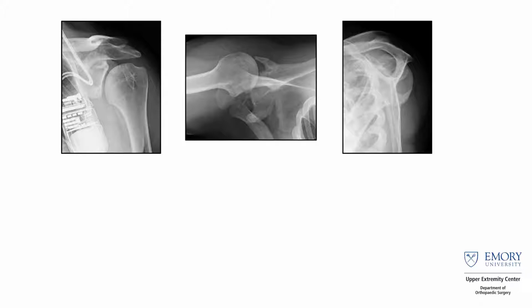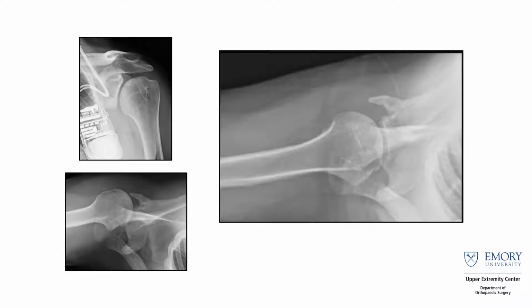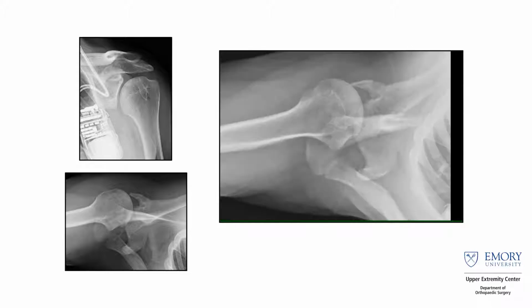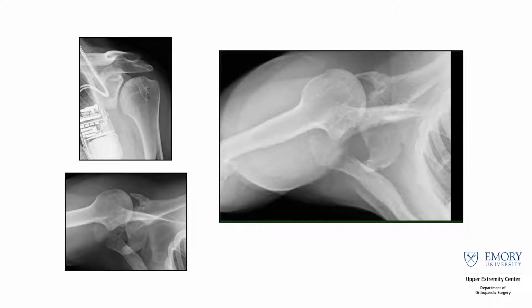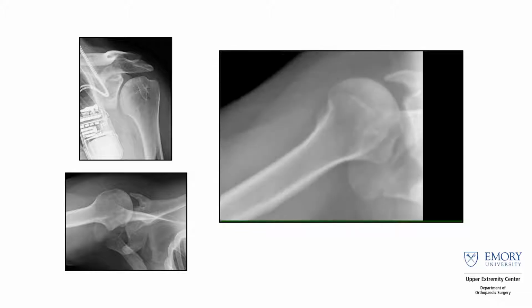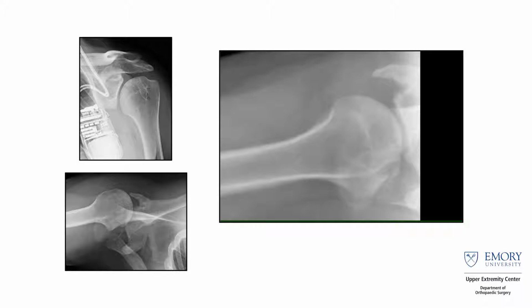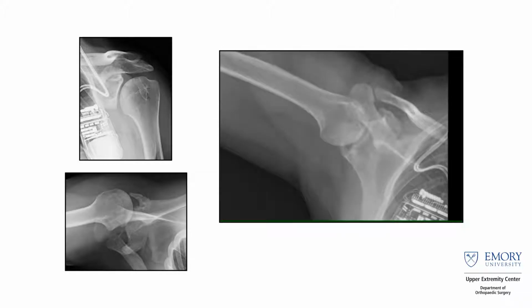There is some posterior decentering on the axillary, and you can also see some posterior decentering on the CT scan. But I think when you see the DDR, you can really get an understanding of what's going on. So you can legitimately see his shoulder sublux from in the glenohumeral joint and then out posteriorly back into the glenohumeral joint and back out posteriorly where that bony Bankart is. So you can see on these multiple views how his joint is legitimately subluxing from inside the glenohumeral joint out posteriorly to where that prior bony Bankart was from, probably one of his 100 plus dislocations.